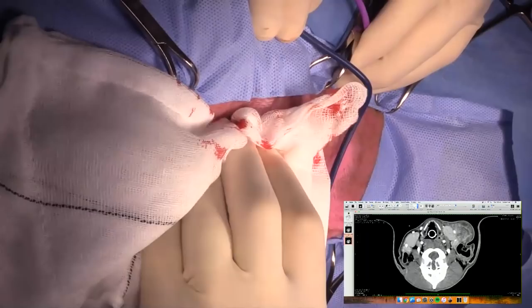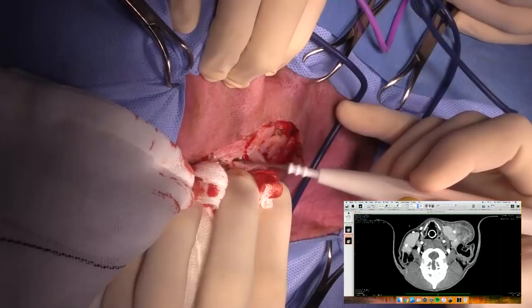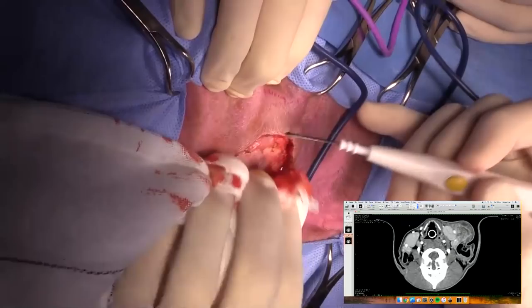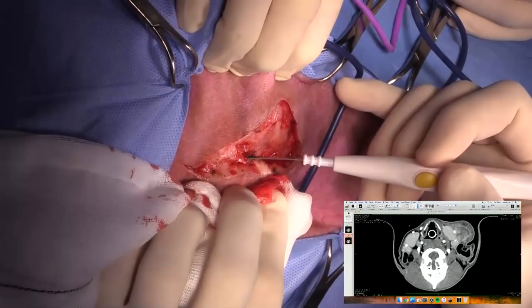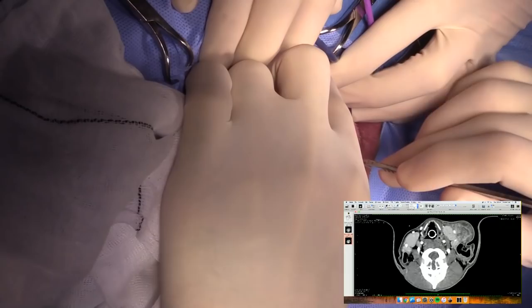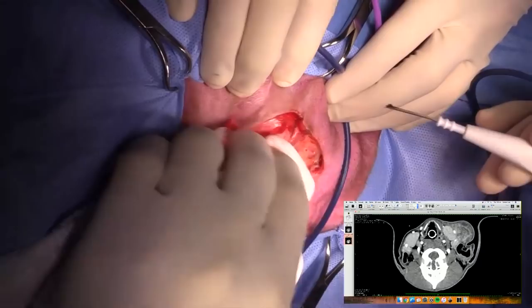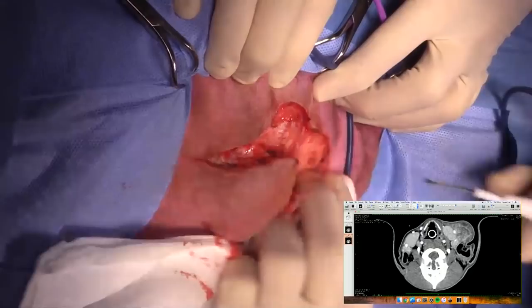Can you retract on that for me, please? Thank you. Nice and vascular. Yeah, it's going to be pretty inflamed in this area, so it's going to enhance the blood supply. And so these are all just cutaneous little bleeders. I would almost not attempt this if I didn't have electrocautery. I could cope without ligature, but electrocautery, I would be whining. You'd run out of hemostats pretty quickly. So that's the wing of the atlas right there underneath. Gets me a little bit oriented.